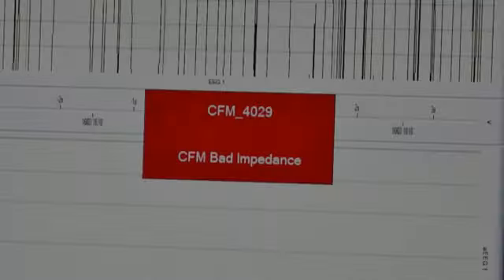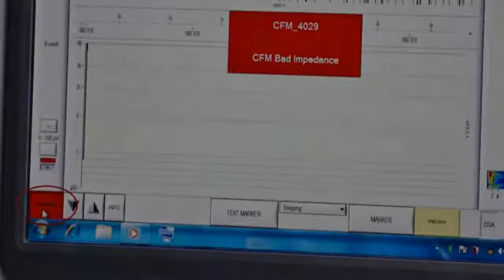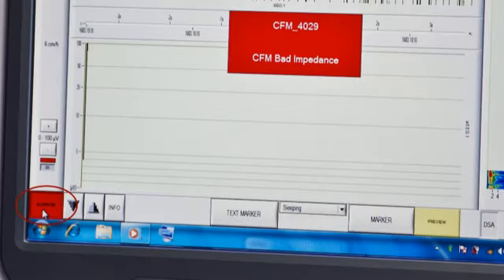If the impedance or amplitude threshold is breached, there will be a visible and audible alarm. The thresholds can be set in the setup menu. To silence the alarm, click the alarm on-off button in the bottom left-hand corner.